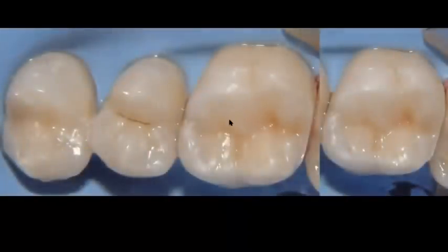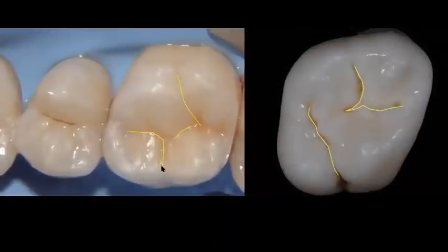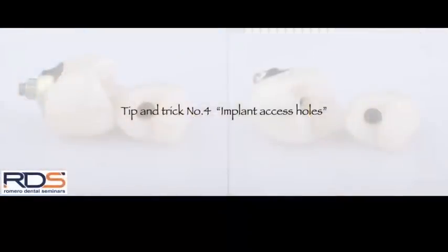And again, you can see the first molar after completion of the restoration, and look at the essential lines. Again, we're just trying to mimic nature using these concepts.